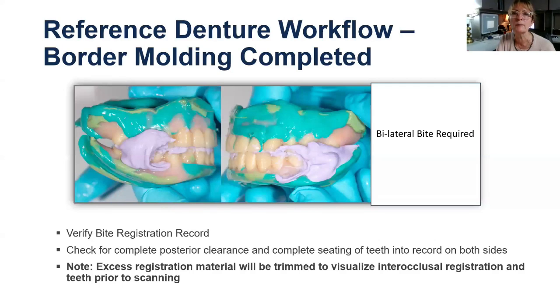Do you scan the denture pickup impression into the impressions? We can send you information on ScanMate. Henry Schein and Patterson, I know, was a distributor for ScanMate, but I can double check that for you. Do you scan the denture pickup impression into the impression setting? On Trios, yes. So the answer to that is on the Trios device, yes.